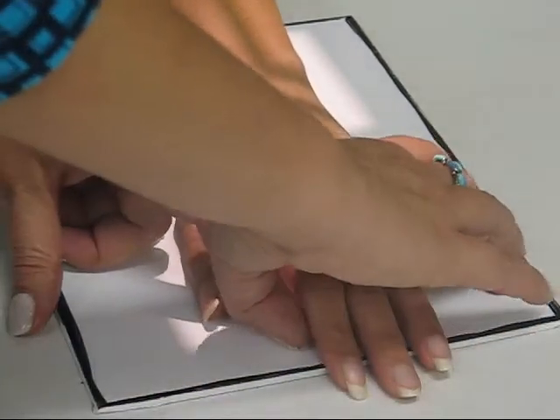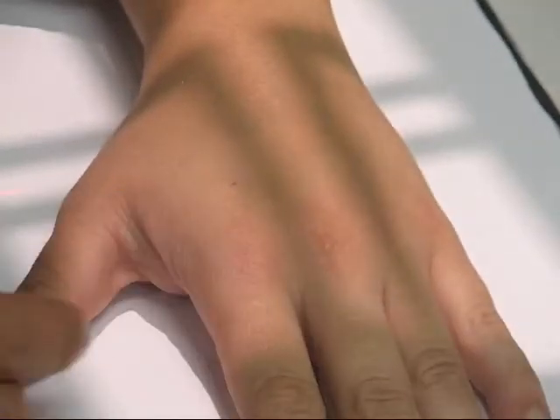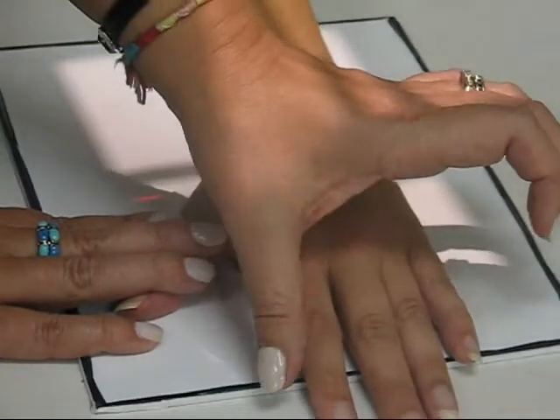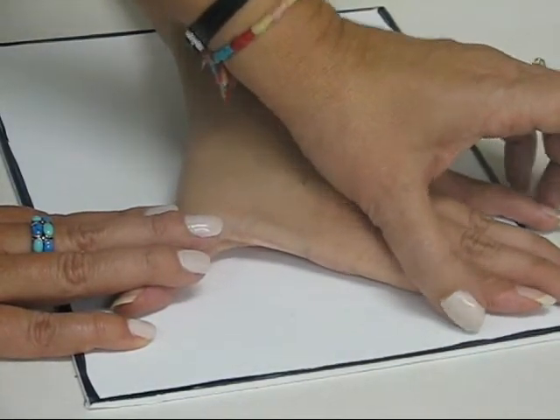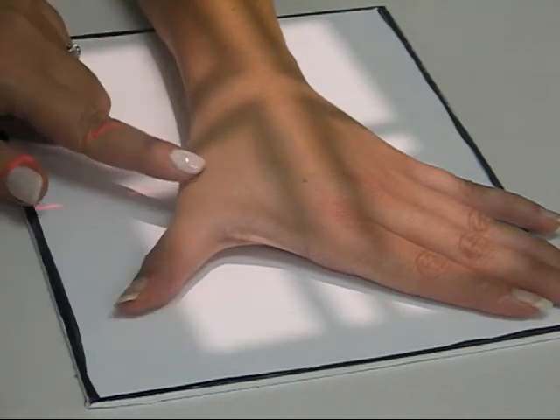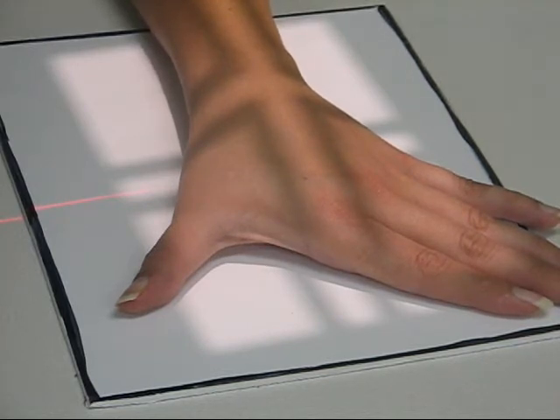And basically what you do is you put your wrist in the PA position, and you hold the thumb in the same spot, and you have the patient move all their fingers out. Okay? And this opens up the space here and brings the navicular out on the resulting X-ray.